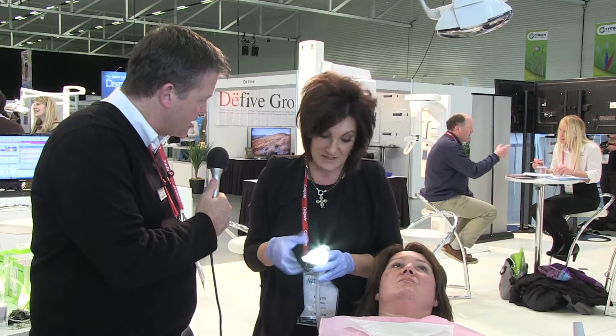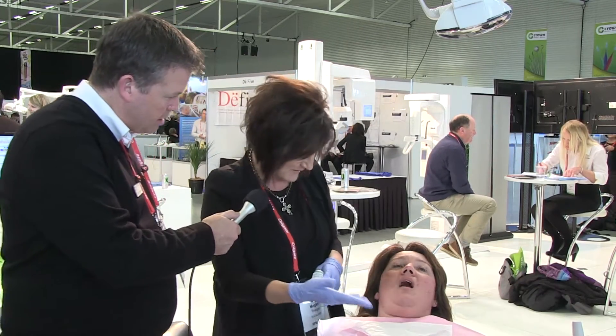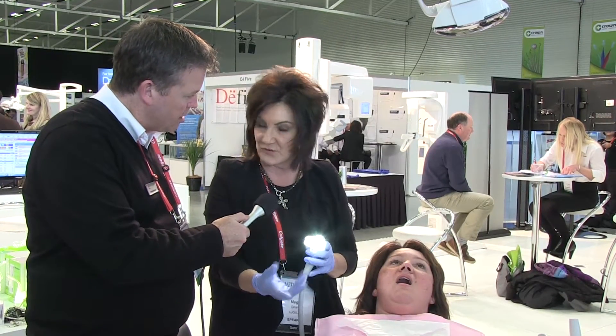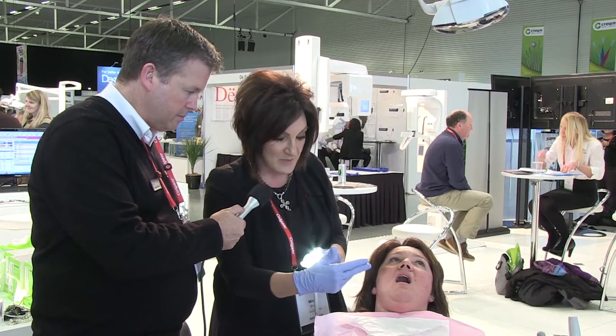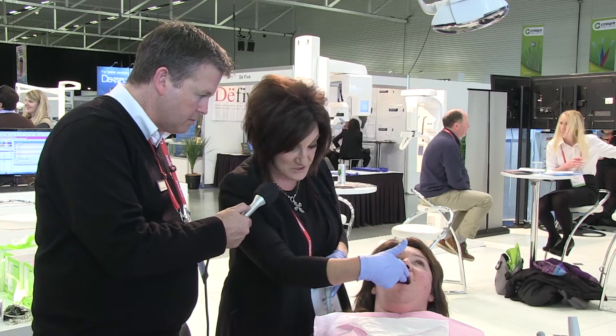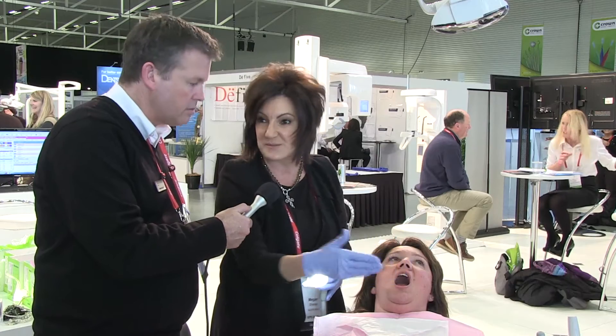How would you determine which mouthpiece is appropriate for the patient? We would ask the patient to open their mouth — they're measured in millimeters, so each one has a different millimeter. We just determine the incisal opening: insert two fingers for a small, three for a medium, or four for a large. It's pretty easy.